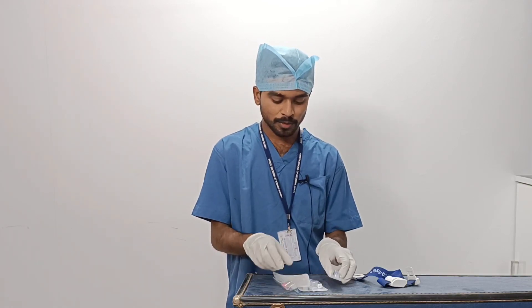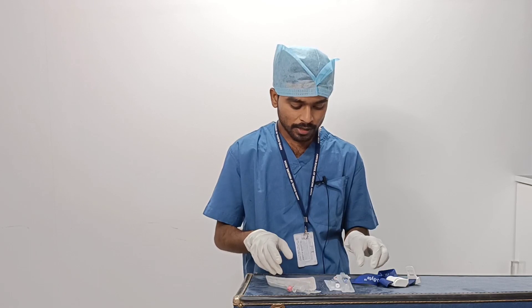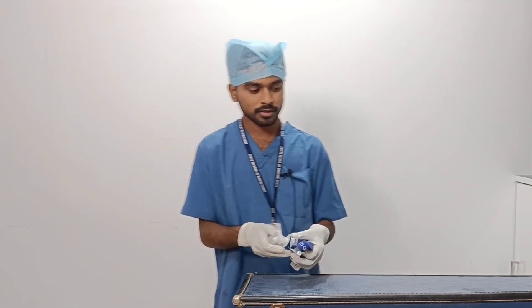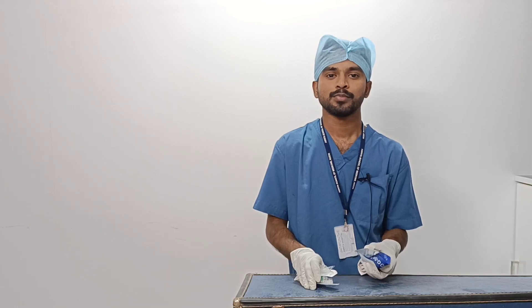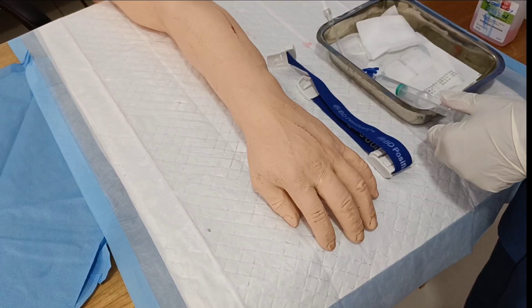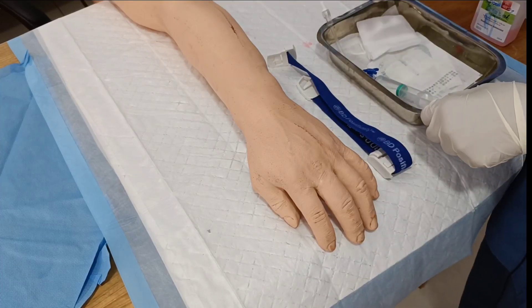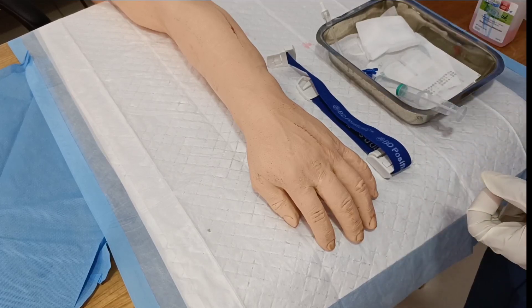After taking consent from the patient, we have to arrange all the equipment needed for IV cannulation — as already discussed. Then we approach the patient after washing hands. The equipment includes: tourniquet, extension with syringe for flushing, IV dressing, gauze pieces, alcohol swab, and cannula.